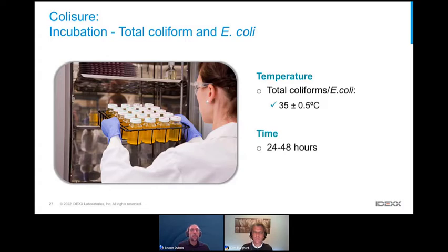Colisure is also incubated at 35 degrees C, plus or minus half a degree. And again, the big difference for Colisure is the time to results. Colisure has results valid from 24 up to 48 hours of incubation.